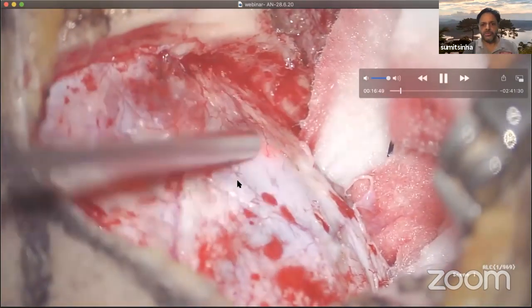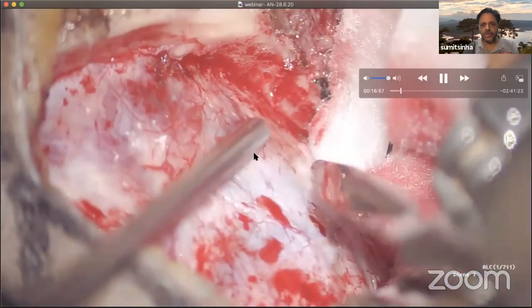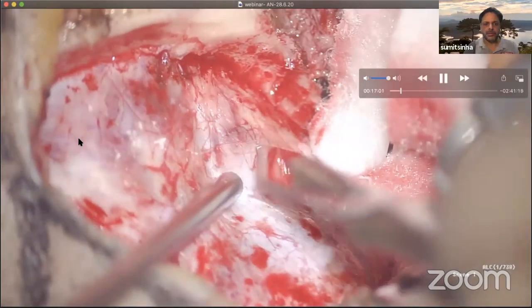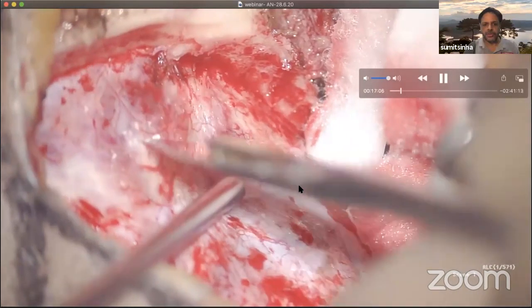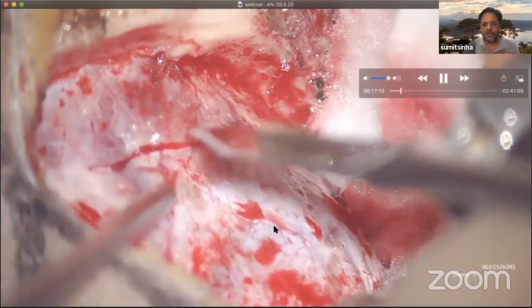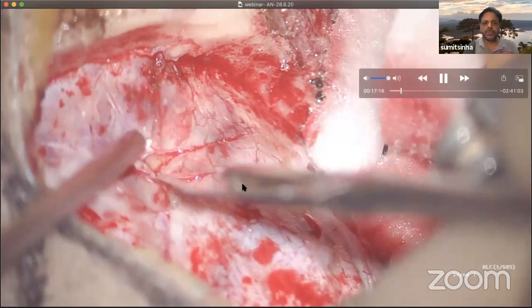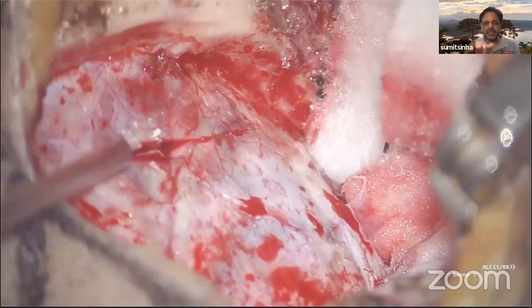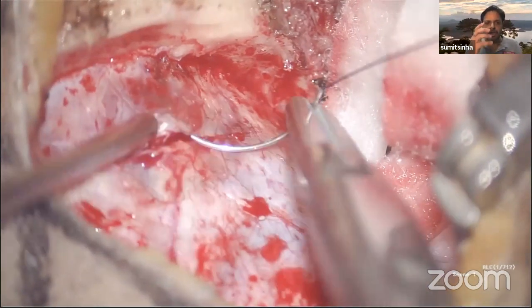The rest of the durotomy is done in an inverted Y fashion, as I told. This limb is then extended up, and this whole dural flap is raised in the form of an inverted Y. Now, try to keep this dural flap as broad as possible. The dural flap which is towards you serves the purpose of covering the cerebellum and protecting the cerebellar tissue from getting dried up with the heat of the light of the microscope.